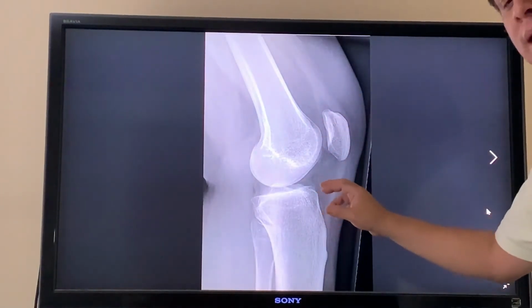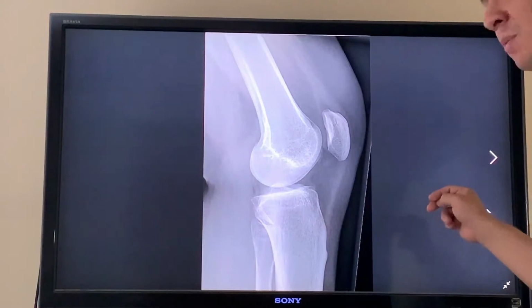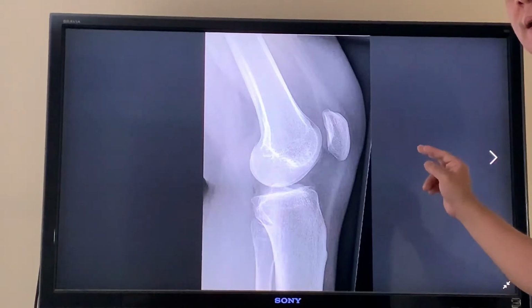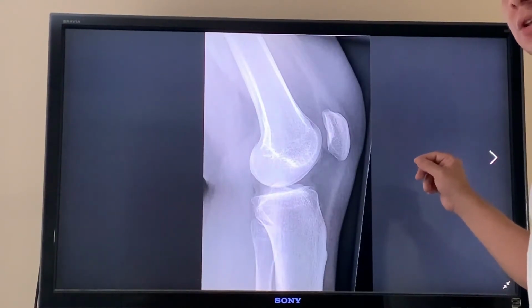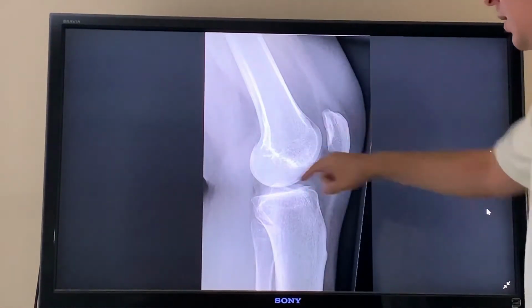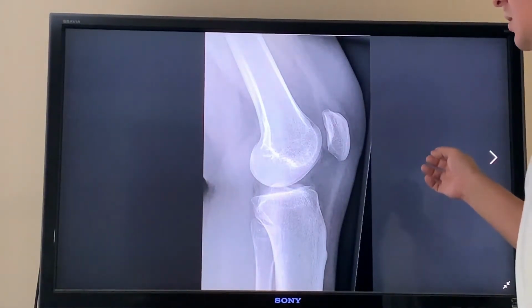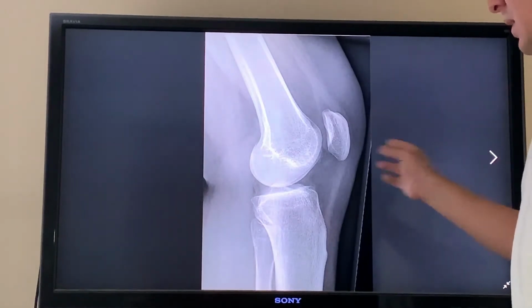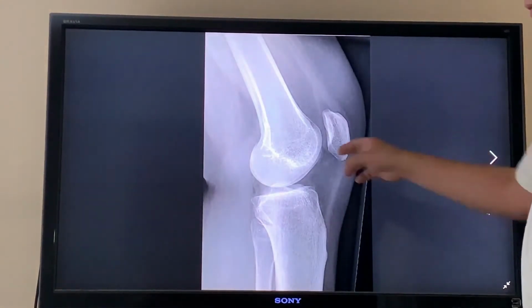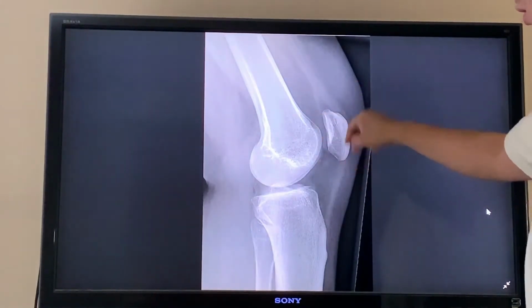There's going to be, again, some superimposition of the tibia over the head of the fibula. And our central ray is going to be a little bit different. It's going to be about 1 inch distal to the medial epicondyle, which is roughly around this section. Our patient is going to be on the side, so we're going to be seeing the medial side superimposed over the lateral side as well. Similar open joints, well, not as much open joints, but again, open joints of this area.